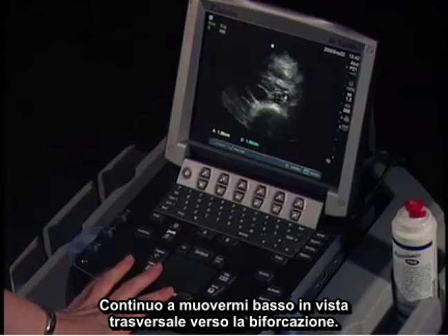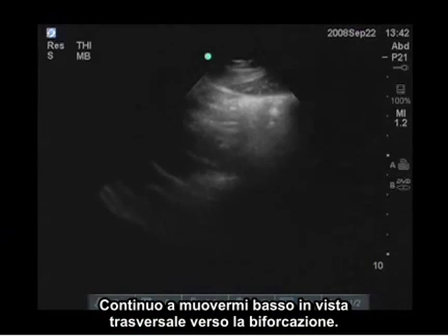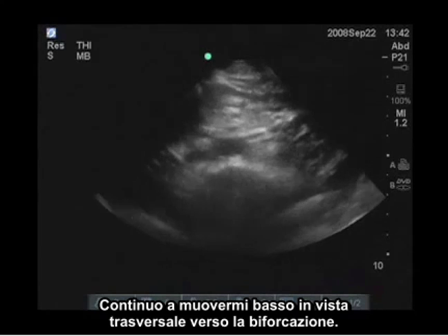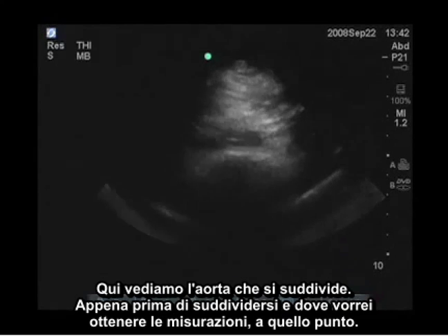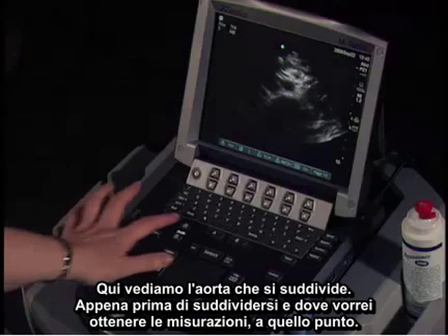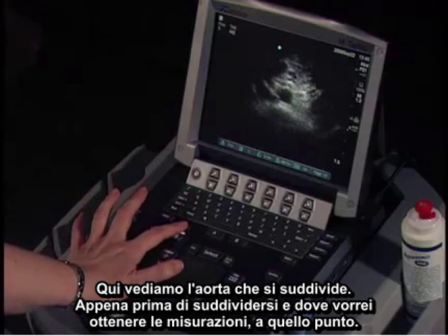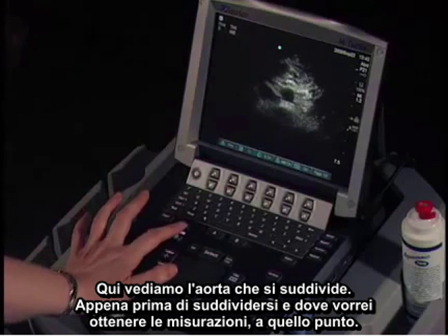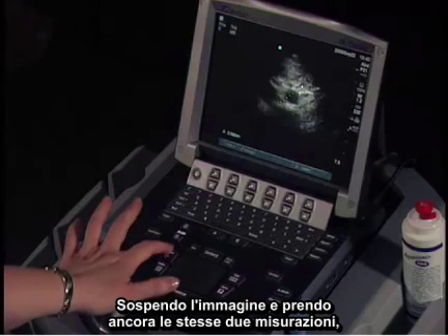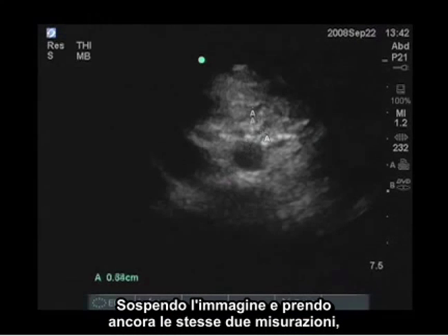I'll keep moving down in a transverse view towards the bifurcation. And here we see the aorta divide. So right before it divides, I want to perform my measurement at that point. So I will freeze and perform the same 2 measurements again.